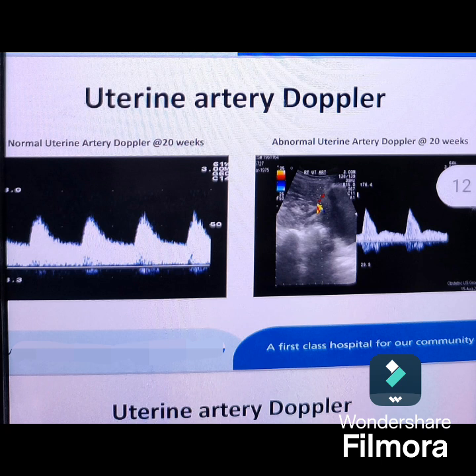That is, the frequency of the sound wave depends upon the relative velocity of the observer and the source. So that was the Doppler principle, whereas Doppler came into clinical use in 1977. Doppler is highly useful in high risk pregnancies. What are the Doppler indices?